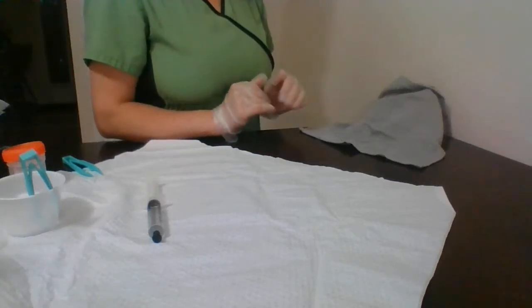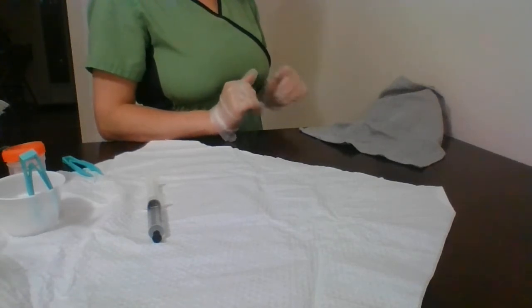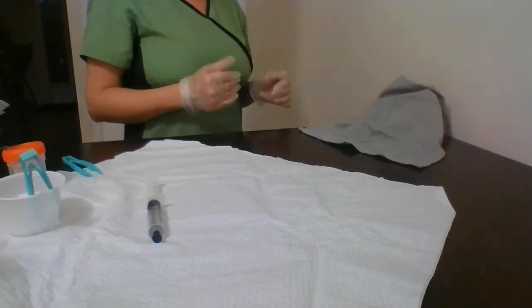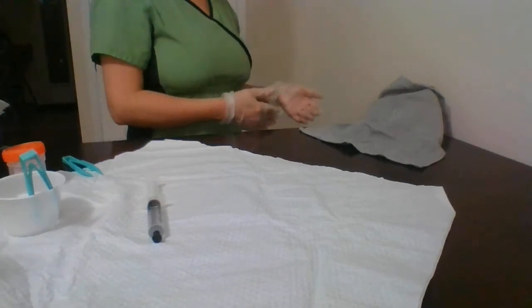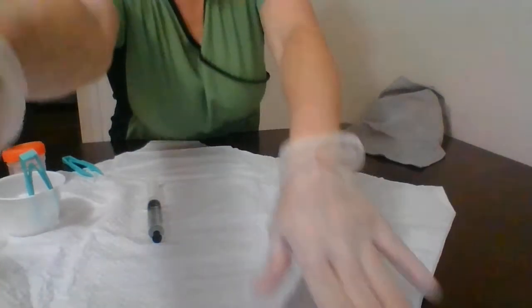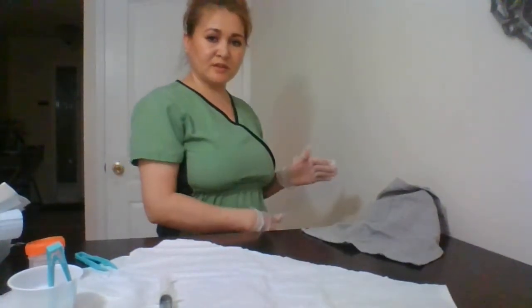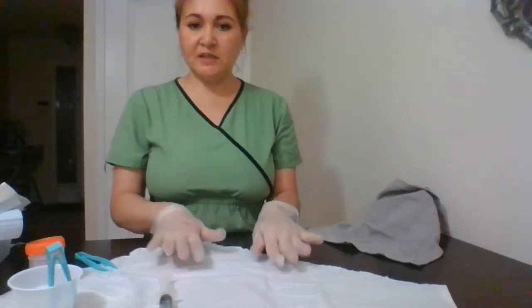So, Mrs. Jones, how are you doing? Do you have any pain right now? Do you feel comfortable? Okay, perfect. In the meantime, I will reposition my patient's bed as well. I make sure the railing is up, and I will make sure that my patient is comfortable and lower the bed as well. While I do the cleaning, I will clean all my station.